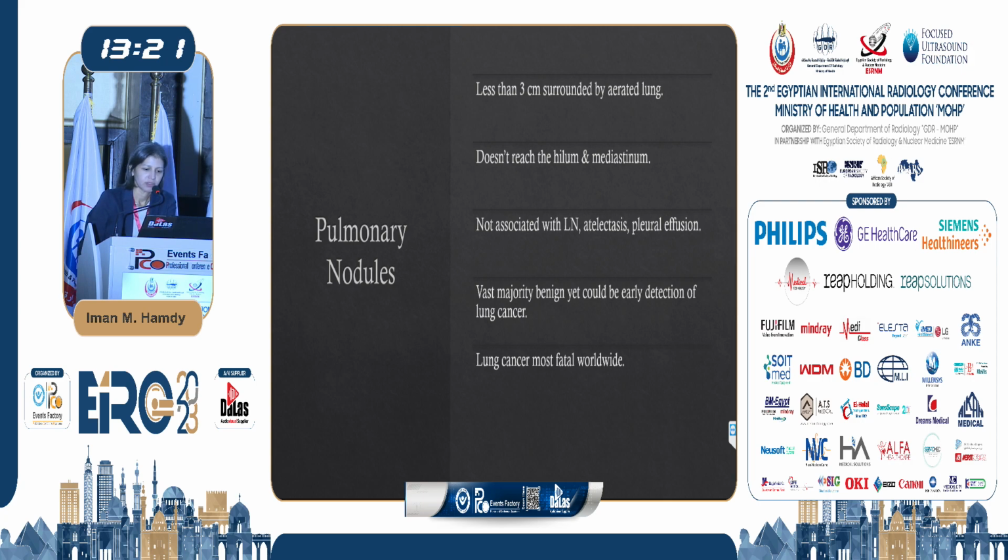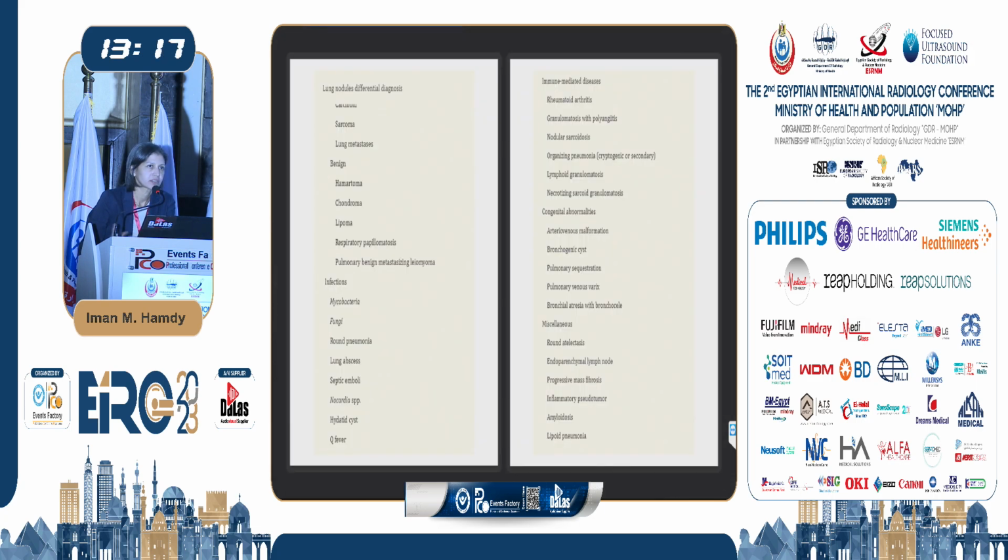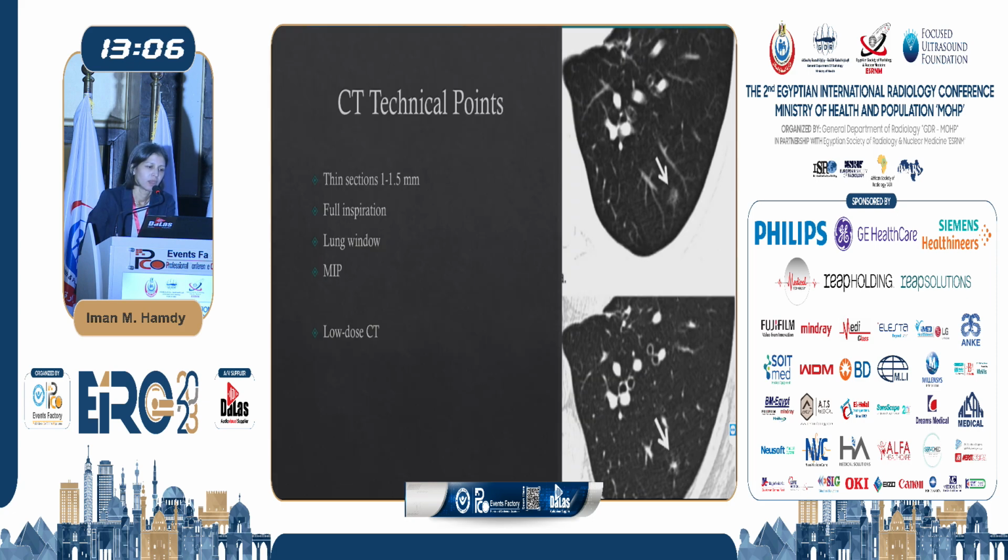As we know, lung cancer is the most fatal worldwide. There is a vast, huge differential diagnosis for lung nodules, whether benign or malignant: infections, immune-mediated, congenital. Before we start dealing with whether they are benign or malignant, we have to make sure that the CT technique is proper, thin sections in full inspiration.